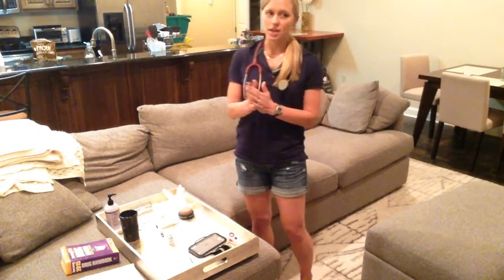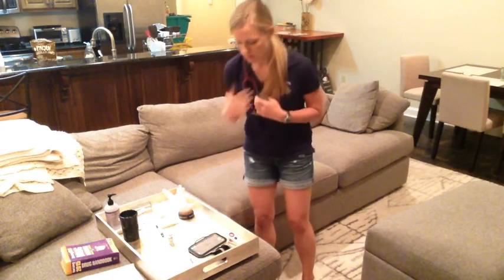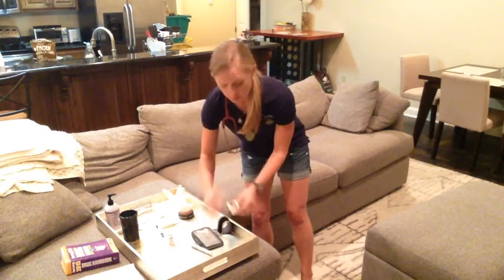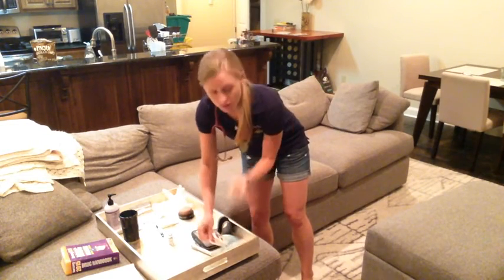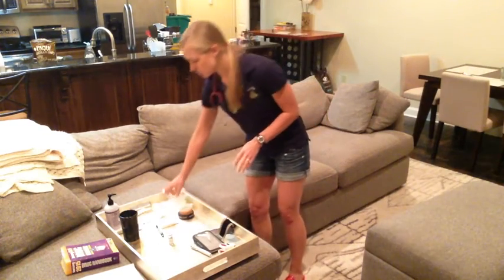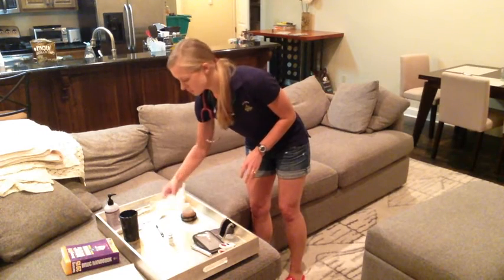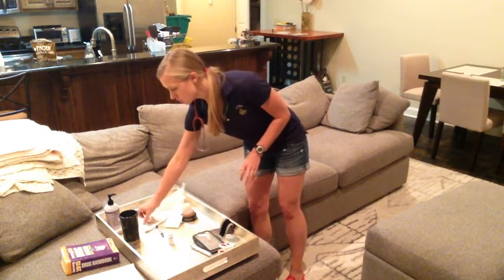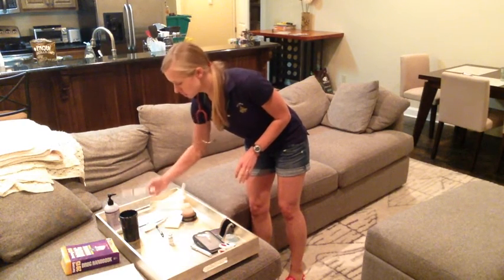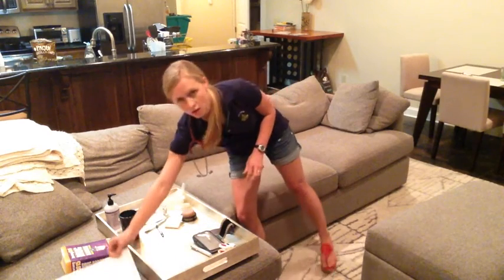We'll start with planning and getting equipment together for my head to toe assessment. I'll need my stethoscope, blood pressure cuff, pen light, pulse ox, and thermometer. And for medication administration, I'll need some gloves, my medication pad, my 2x2 gauze, a label, my alcohol swabs, my needle, my medicine vial, and my MAR also.